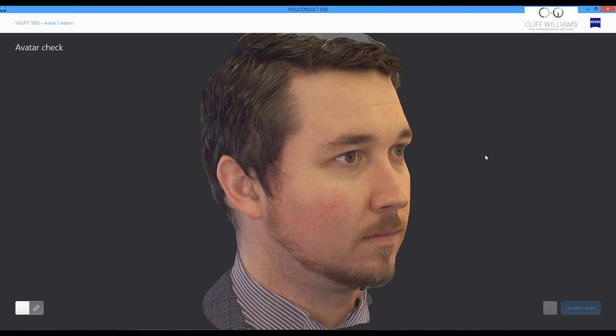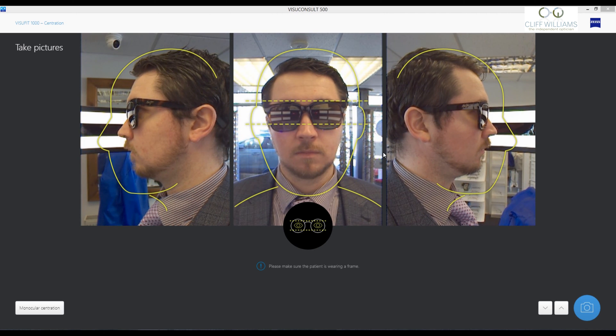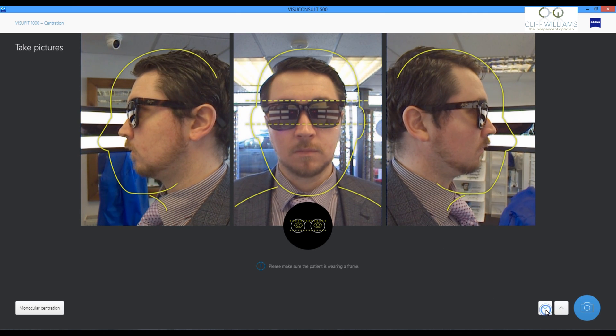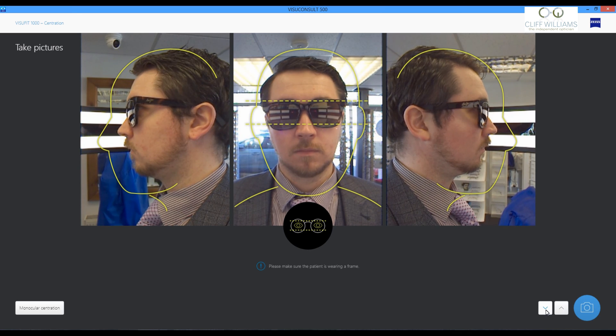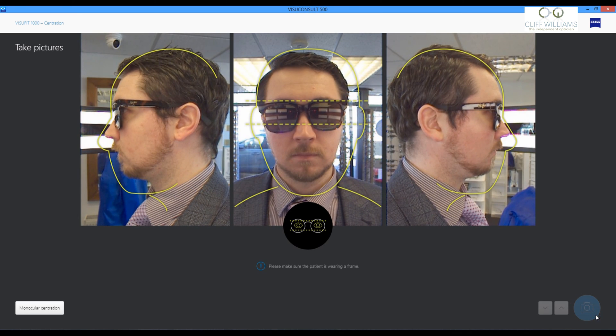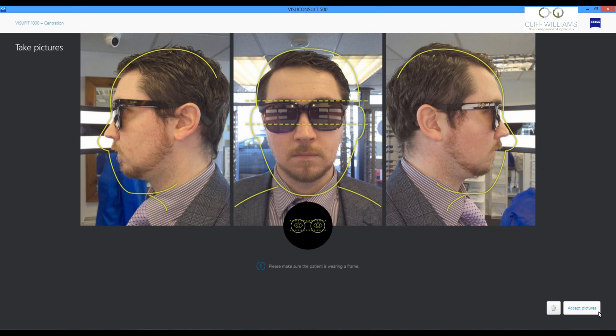As you'll see with this it's quite hard to see the side of the eye. We could take the lenses out of the frame to do it. But the frame may distort in the process. So this new method allows us to do it much more accurately.